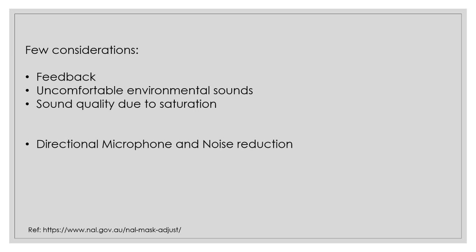Number two, we have amplified the sound. So this amplification may not be required in all environments. That would become too much for the hearing aid wearer. So recommend them to use it only when they need it and to switch it off when they don't need it.